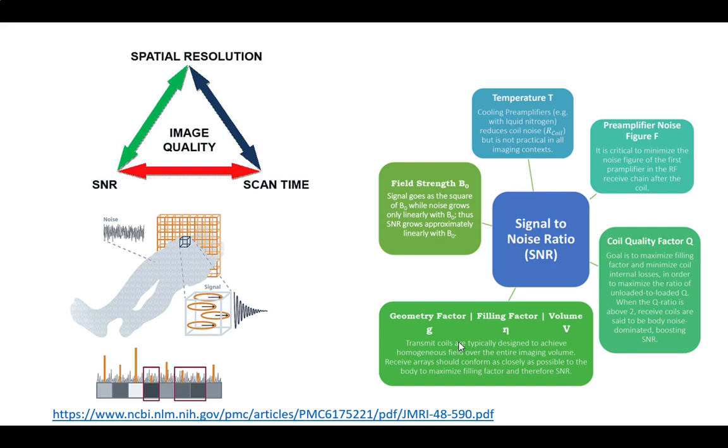So as I keep increasing that, this is why when I made the statement, yeah, it's completely safe, but then I said not everything, no matter what it is, there's no such thing as completely safe. But as far as completely safe goes, this is it. When I get too much power I'm pumping into you, I start cooking you. So there is a little bit of a trade-off on these type of things.